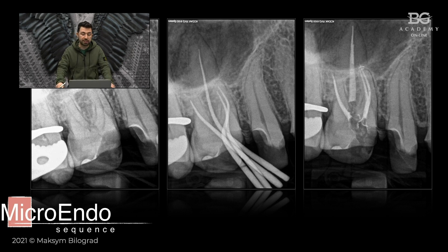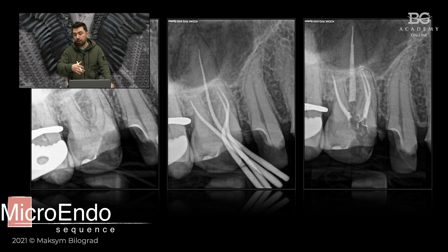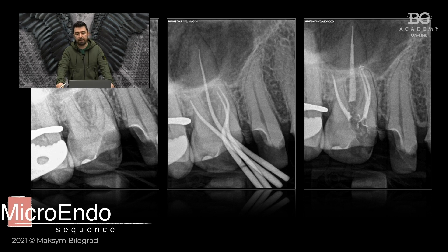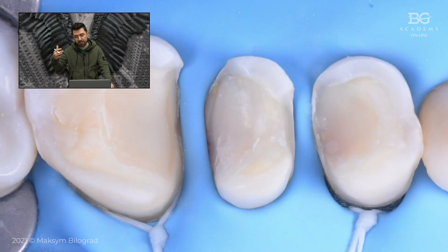Then I completed the endodontic treatment. The only thing I was not able to do was achieve patency to the distal apical side — there may have been a ledge. So we instrumented to the ledge, performed heavy irrigation, completed obturation, and we have follow-up of this tooth. Everything works perfectly.